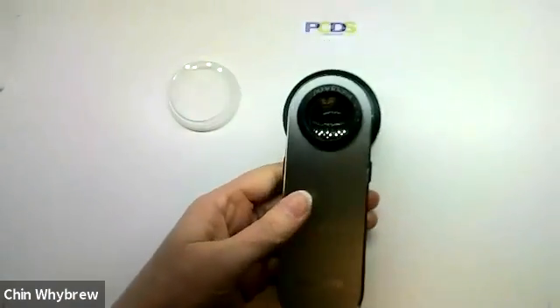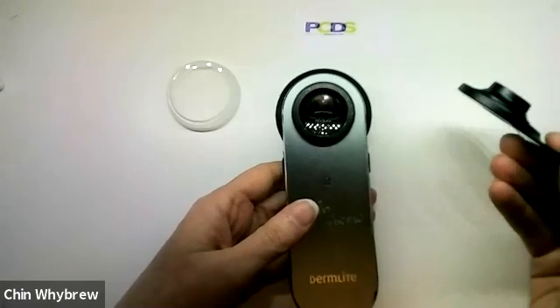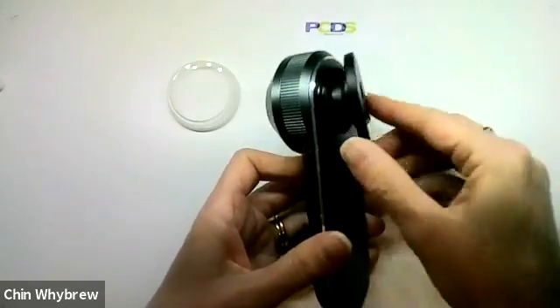It's worth pointing out, though, that it will only work with the DermLite adapters. The Heini universal adapter has a bit that sticks out, and so it doesn't get such a good connection with the magnet.